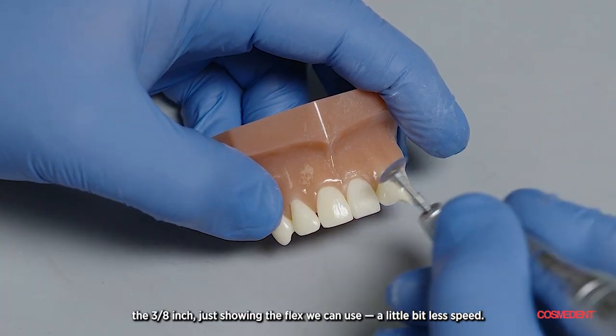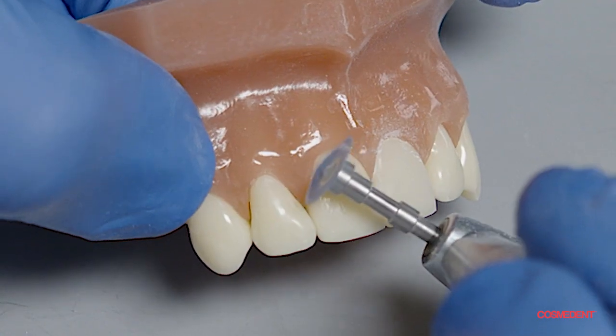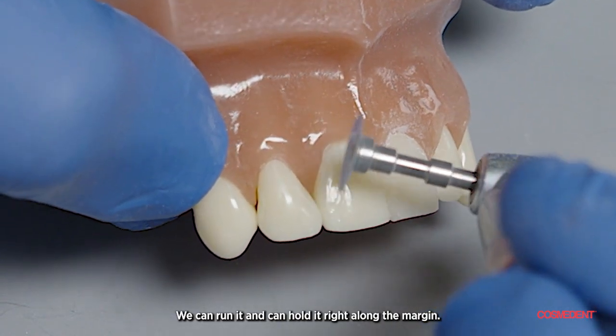Now showing the three-eighths inch disc — just showing the flex we can use with a little less speed. We can hold it right along the margin.